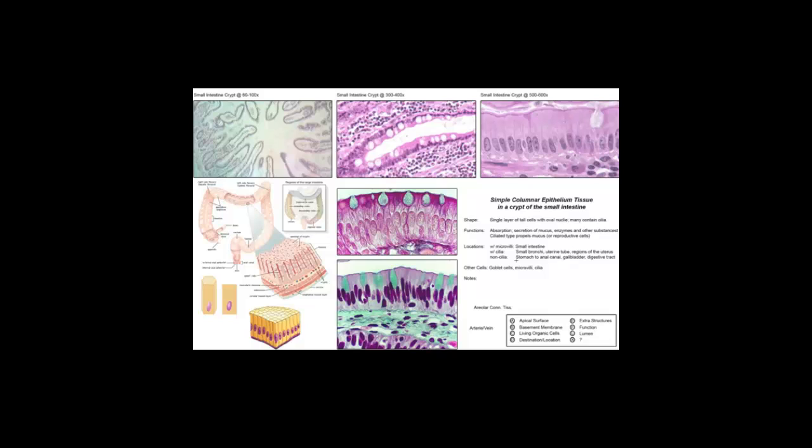Okay, this is in the small intestine and digestive tract. This right here is probably the best microscopic depiction of these columnar cells in this location. A basement membrane down here closest to the nuclei would be present. We would have a number of different structures below this lining. For example, this would be a cuboidal lined submucosal duct of a gland.